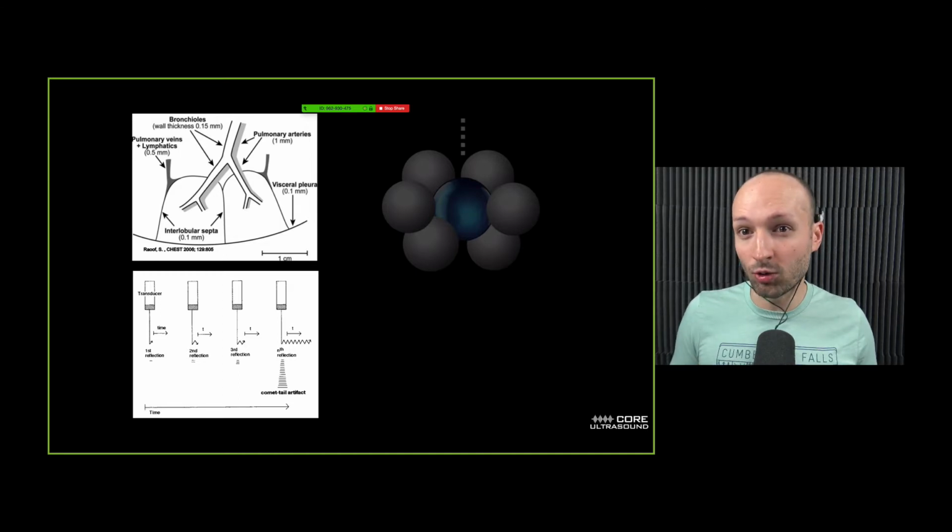There's just kind of CT correlations that was done basically by one guy in France. Utmost respect for the guy, but experimentally, there's been another model that has actually been shown to generate B-lines, and it looks a lot more like what I think would happen. Now, remember, I said when you have air, it actually reflects sound, right?